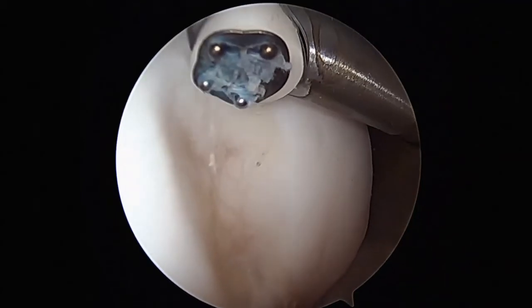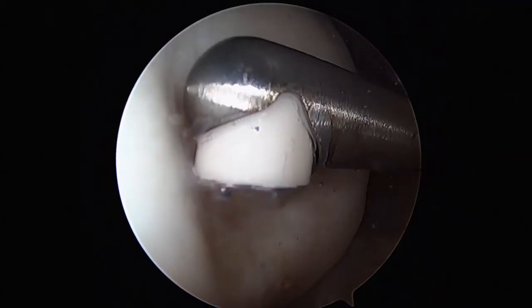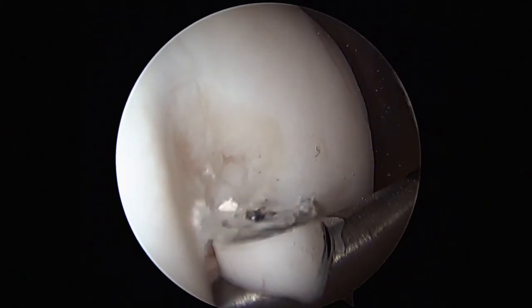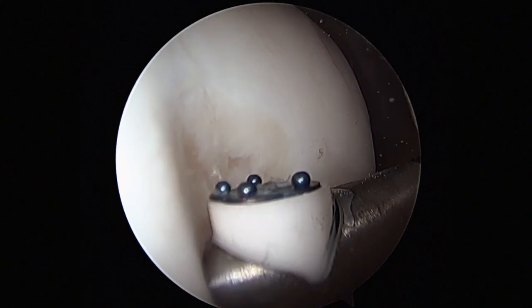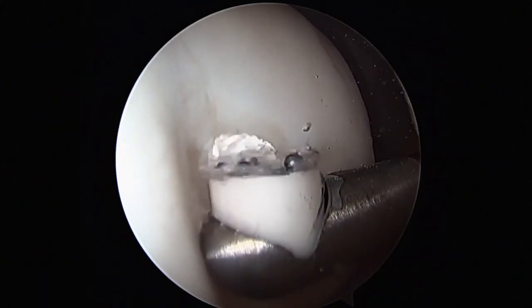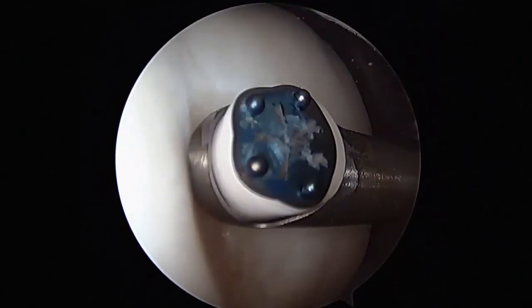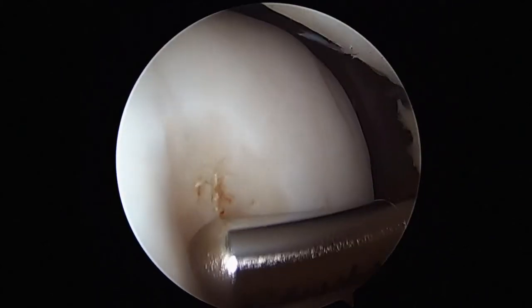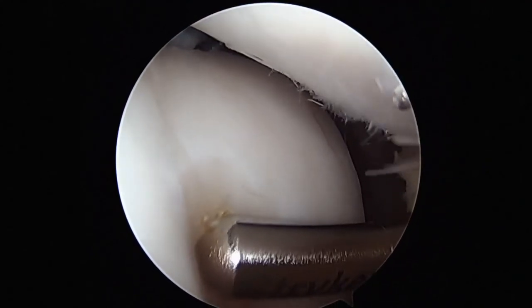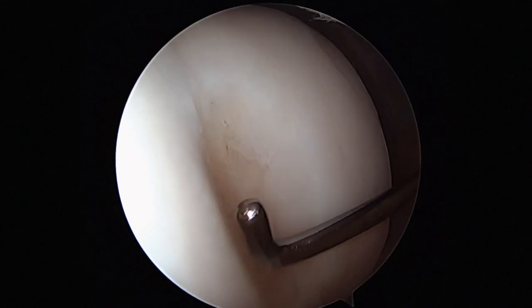The advantage of this technique is that the fluid management system allows instrumentation to be removed and exchanged without significant iatrogenic damage or worry. The RF wand addresses the chondral pathology far more easily than the chondratome itself, and the supralateral portal enables directional activity, meaning that you can address pathology without causing damage to other surfaces throughout the knee.